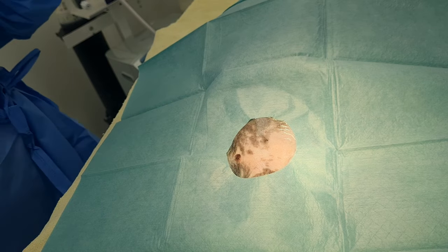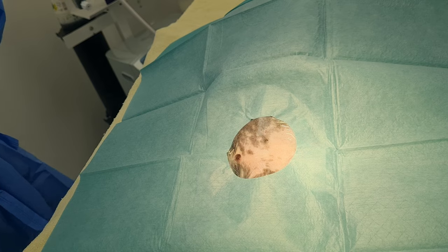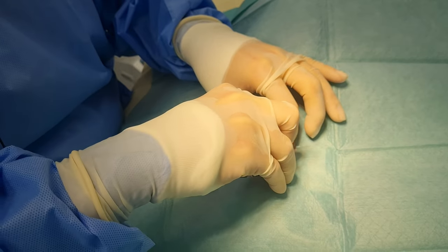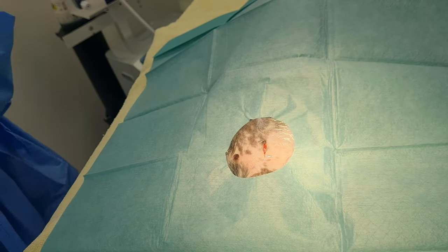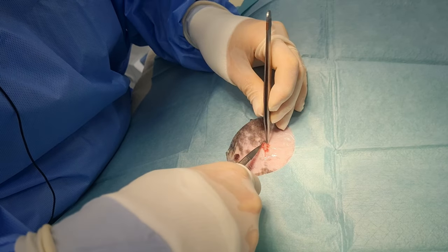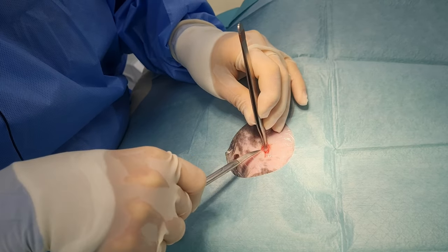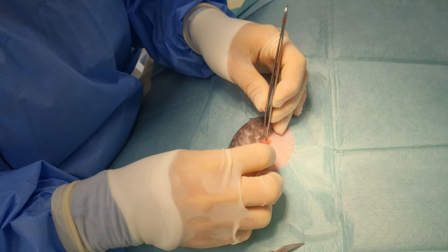Chip has been anaesthetised with medetomidine, ketamine, and methadone IM, and then he's had maropitant and meloxicam subcutaneously and some fluids. I use methadone for all of my small furries for their surgeries — I find it works really well. With these hindgut fermenters, yes there may be a slightly increased risk of gut stasis with the more potent opioids, but that's by far negated by the superior pain relief. I am using meloxicam by injection at the dose from the formulary rather than the licensed product dose.